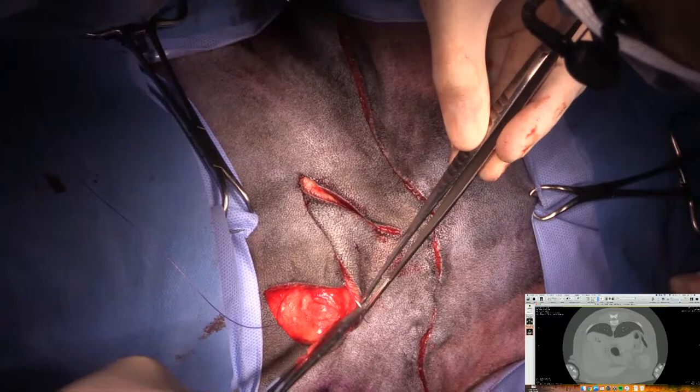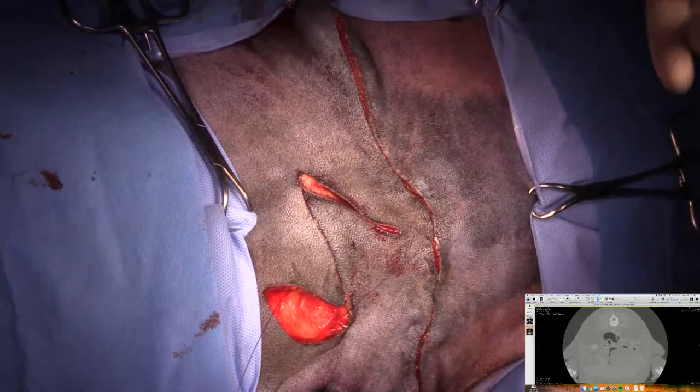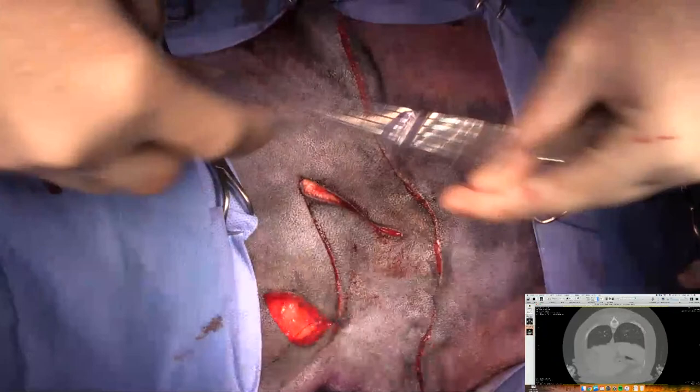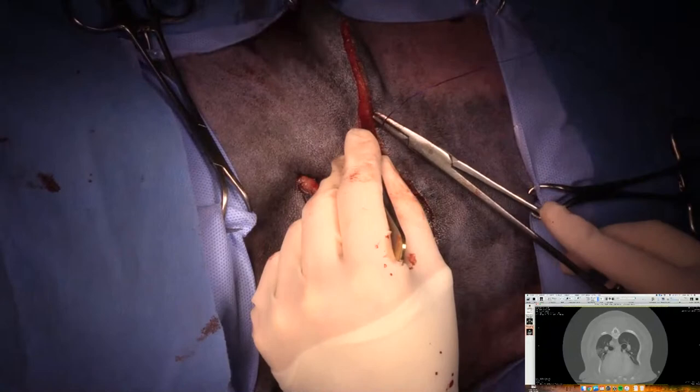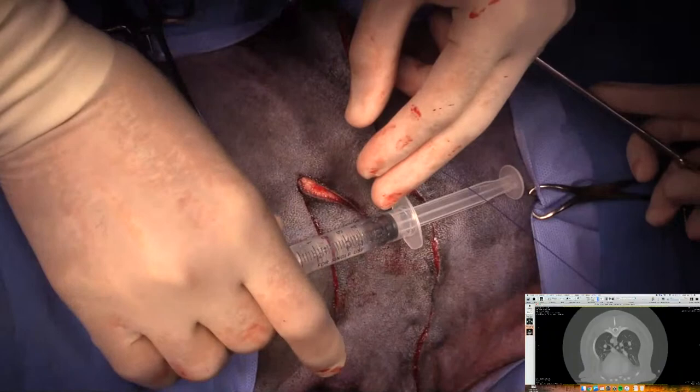Just externals, externals or intradermal, whatever you like. He's a basset, or she's a basset hound, and she's about 5, I think. Now let's measure that length here. So we picked up about 2 centimeters, something like that.